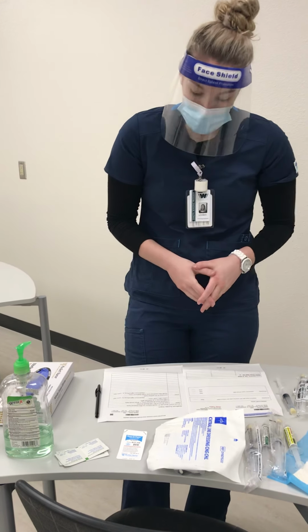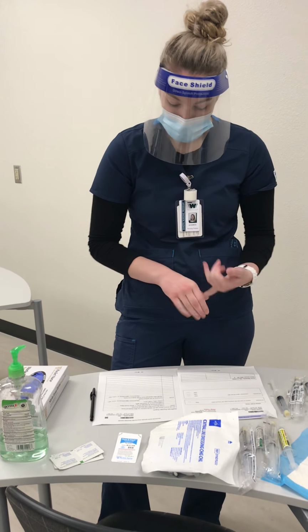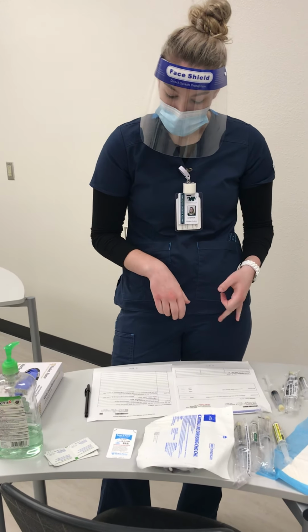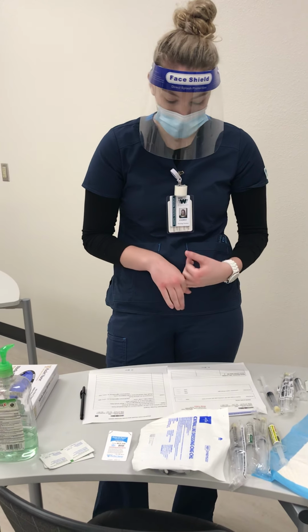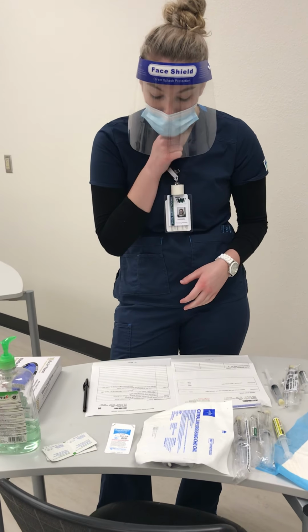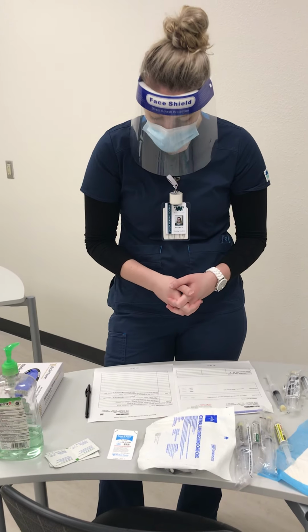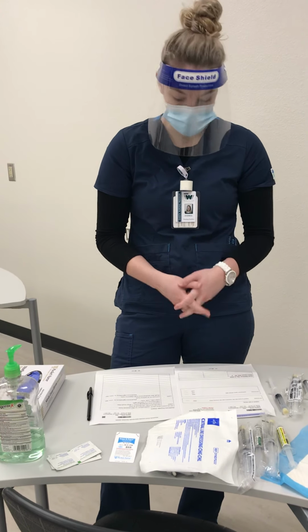So they're requesting a CBC and a CMP right now, so I know I need to do the blood draw. And then Mr. Chest currently has an infection, so I know I need to give the ceftriaxone, and it has been over the 8 hours, so I'm okay to give that today as well. And then the dressing change was 7 days ago today, so I'm going to change that for him as well.